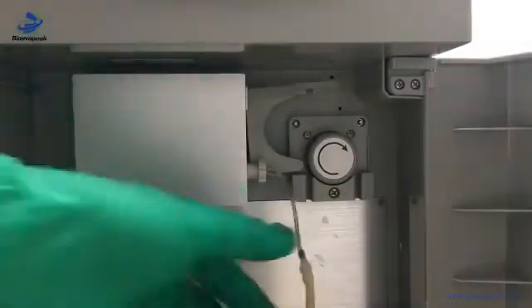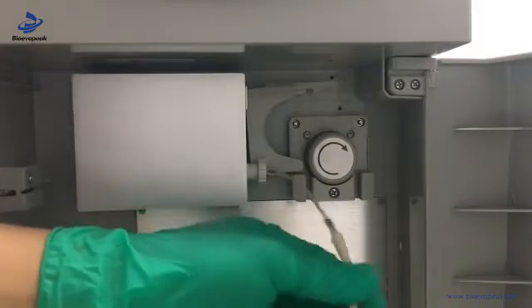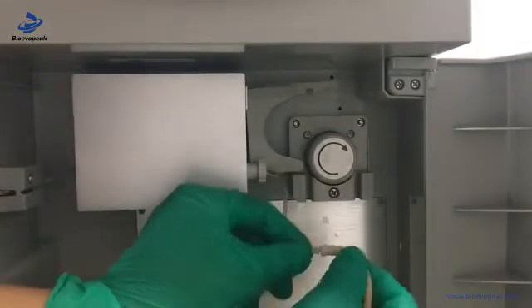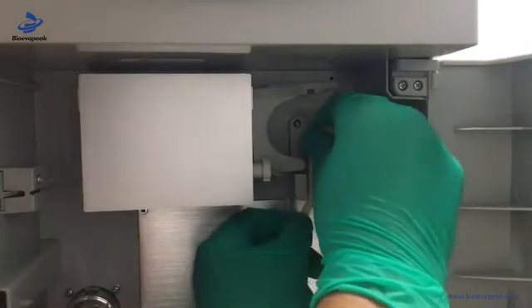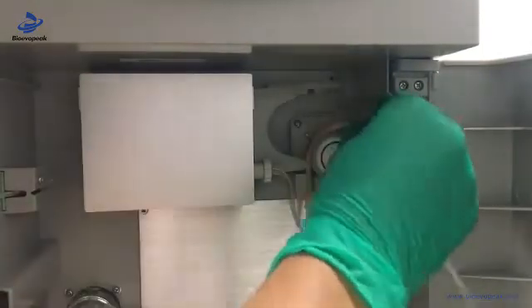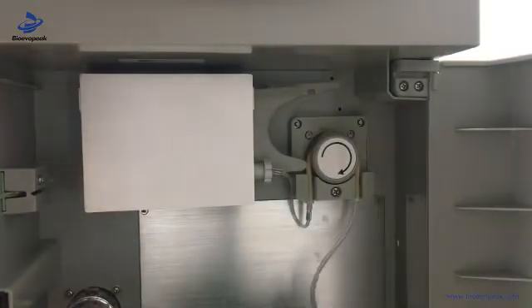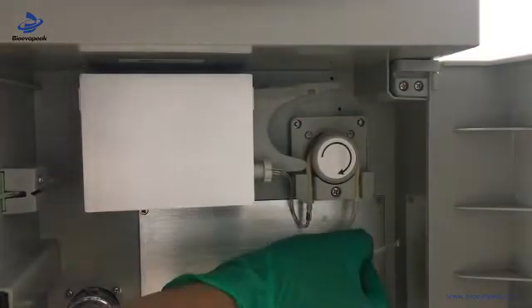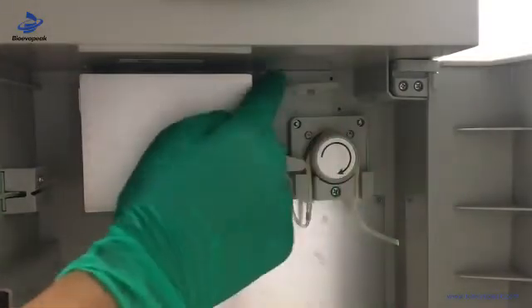We take the pump tube and give some stretch and massage to the tube. Then we hold one end, keep it going around the tube, then fix the other end. Then we put the tube through the hole, and we can close it.